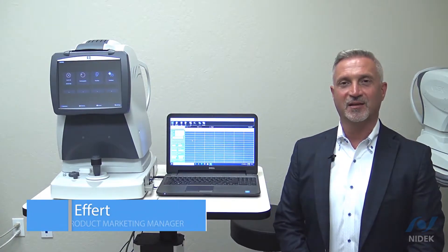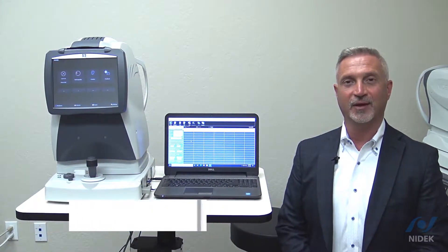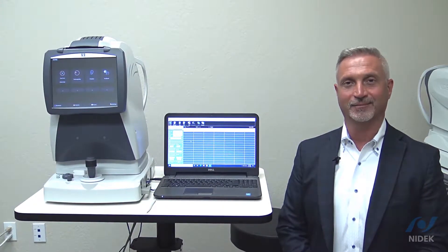Hello, my name is Keith Effert with Nidec. Today I'm going to provide a brief demonstration on the Nidec MP3 microperimeter.